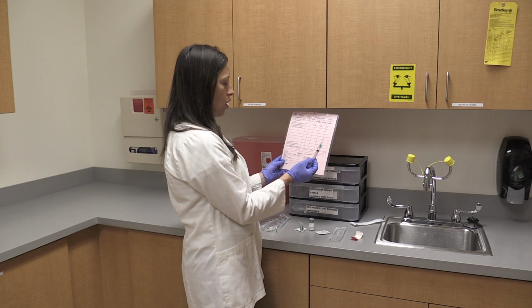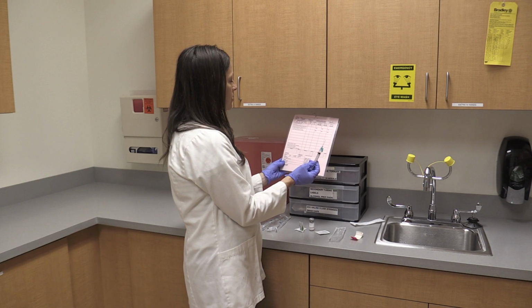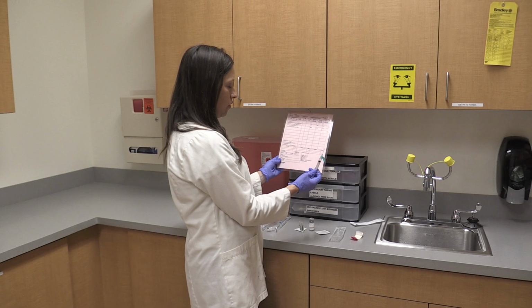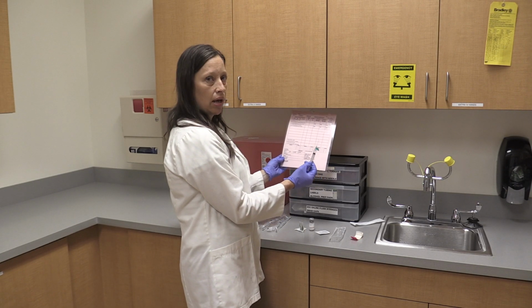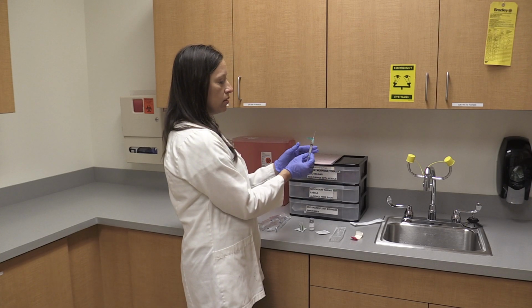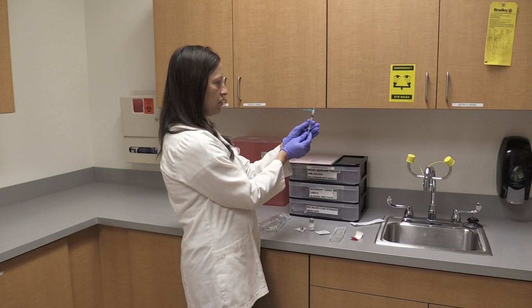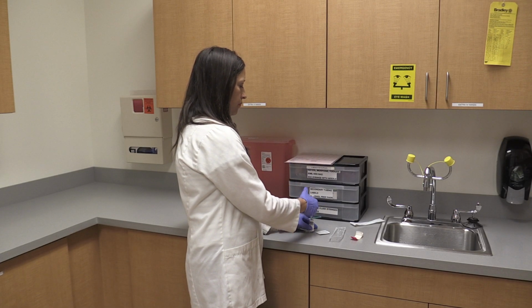determine again how many milliliters I need to pull up. So I see that the concentration I have is 4 milligrams per ml, but the dose that he's supposed to get is 2 milligrams. So that means I'm going to pull up half an ml. I'm going to pull up half an ml of air and insert it into my vial.